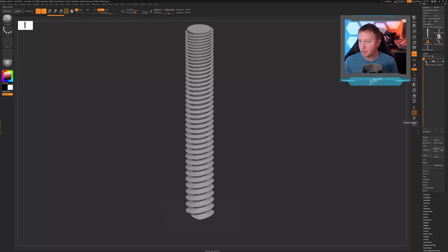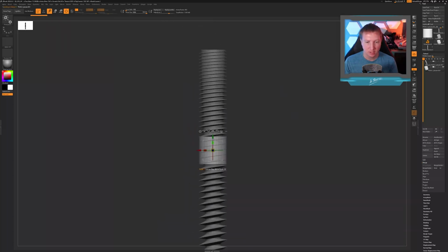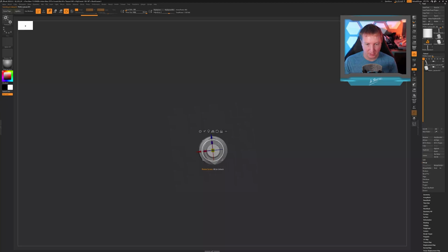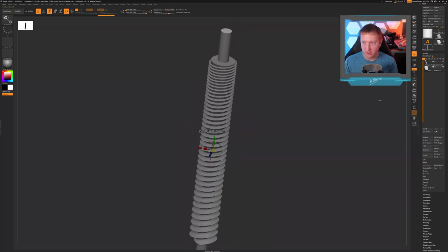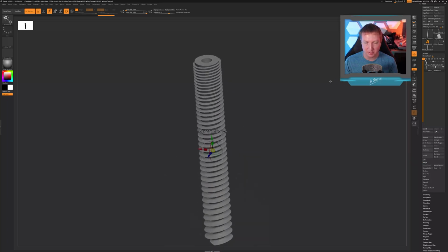I'm going to come up here to my subtool menu and add another cylinder. I'm going to take that cylinder and make it narrower in diameter and lengthen it to the length of the screw. Okay, let's just figure out what size we want this. I'm going to bring this a bit smaller. That looks pretty good. Now I need to turn on live Boolean here, and we will subtract that from our front shape. All right, so now we have a cannula through the center of our screw.